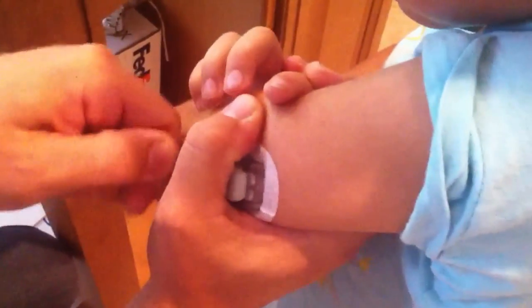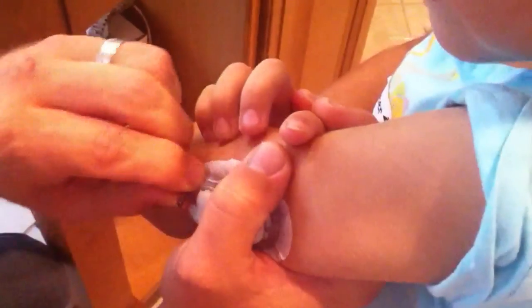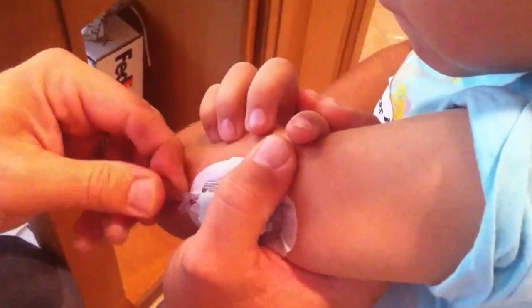At the end I just got to take this piece out — it's supposed to wiggle out. Isn't that so much easier than yesterday, Ella? Okay, why isn't this piece coming out? So it's already attached — we're just taking this piece off. There we go. All right. Done.